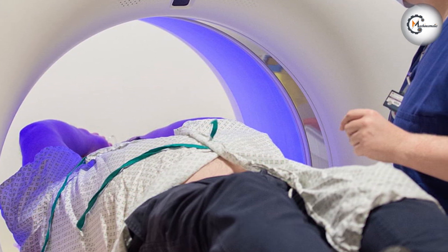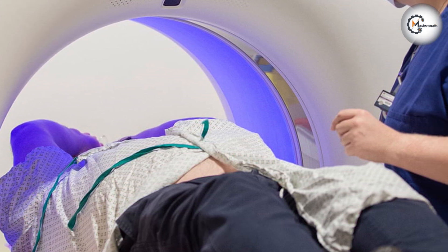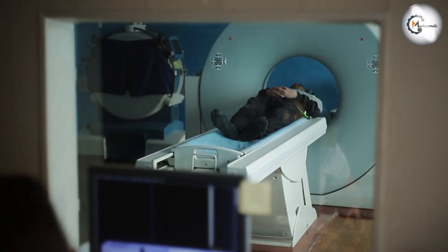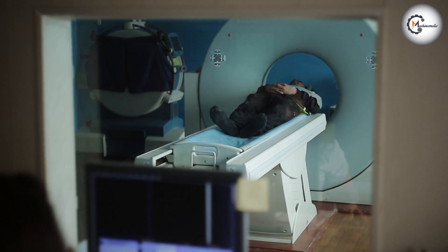This imaging technique uses specialized software that converts the images into 3D images of the heart, allowing doctors to see the heart and blood vessels from different angles.